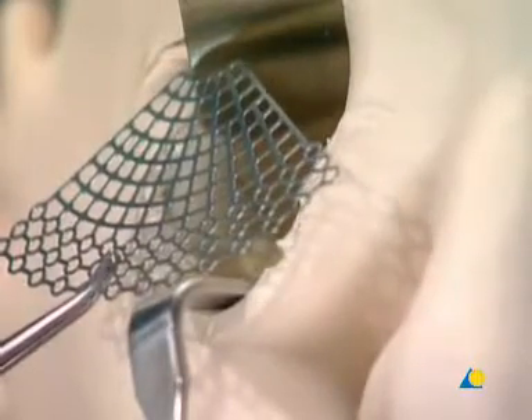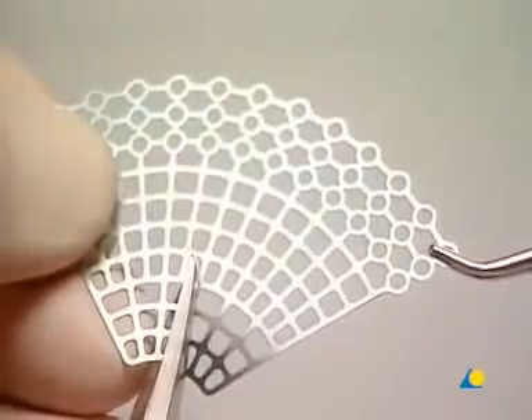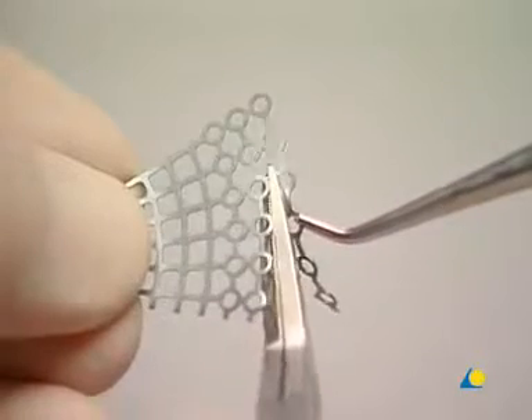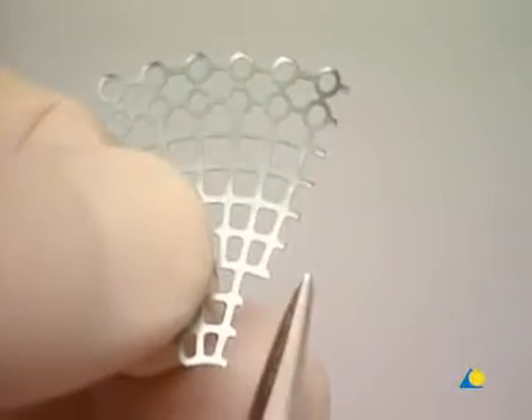The manipulation screw is removed. The orbital floor defect is exposed by using an orbital retractor to pull back the globe. A 1.3 orbital floor mesh plate is selected to repair the orbital floor defect; its radial design fits the conical shape of the orbit. Using the mesh cutter, the plate is trimmed to the correct anatomical size. It's important to use a large enough plate to span the entire defect, with sufficient screw holes to secure fixation to the infraorbital rim. All sharp edges of the plate are trimmed off to protect the soft tissues.